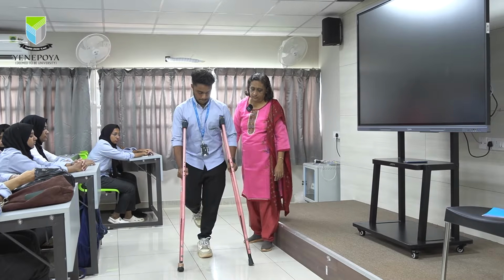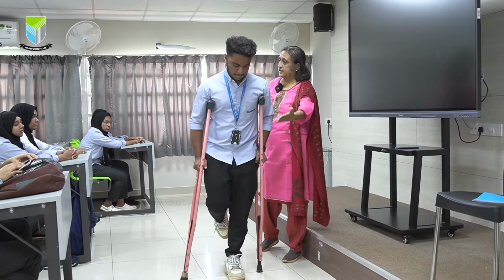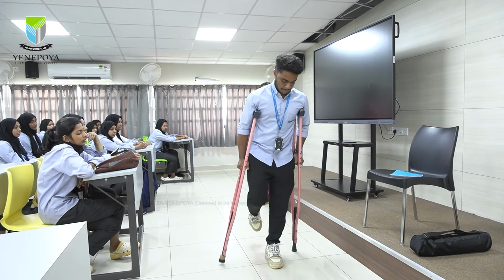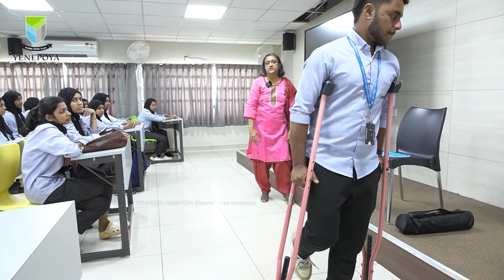Just 1, 2, go more beyond. So, he is going more than the border of the crutches, that is he is swinging through the line. This is a faster walking pattern.